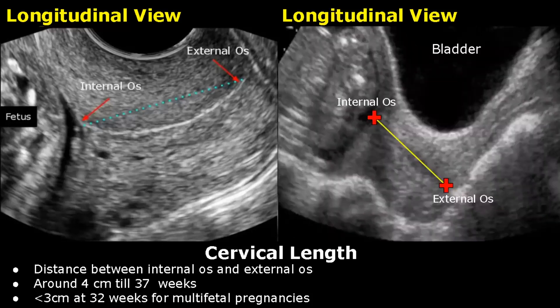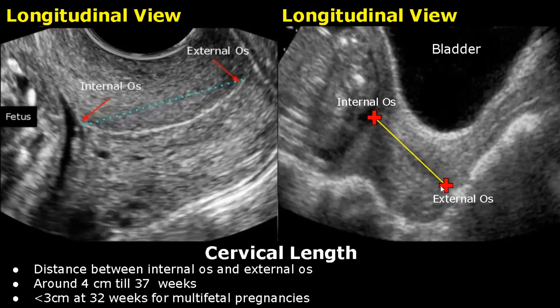This is a transabdominal view. Cervical length can also be taken in a transabdominal view, but it is not accurate because the full bladder often leads to an increased value of cervical length. This is the internal os, right here — one caliper is placed here. And this is the external os — the other caliper is placed here.